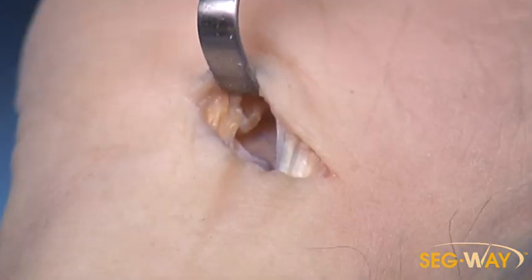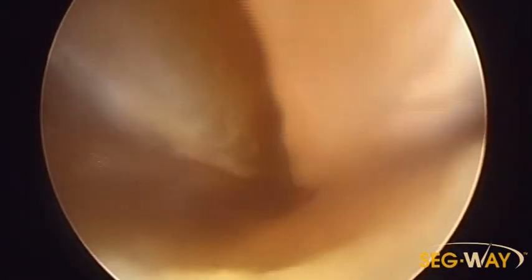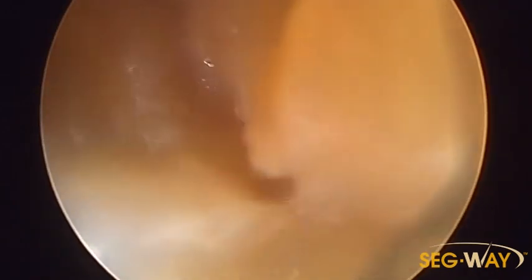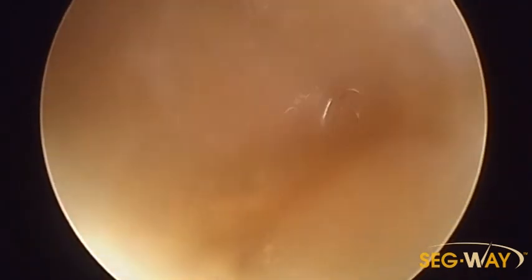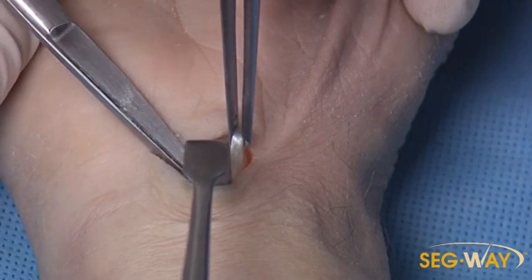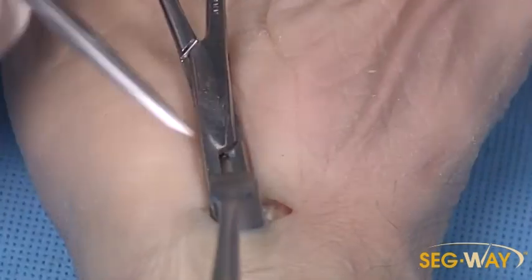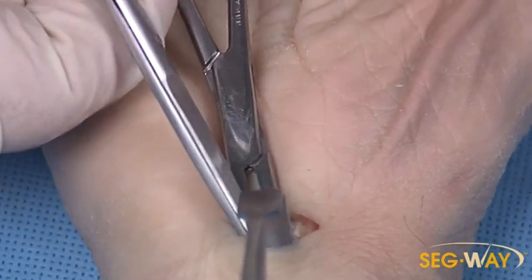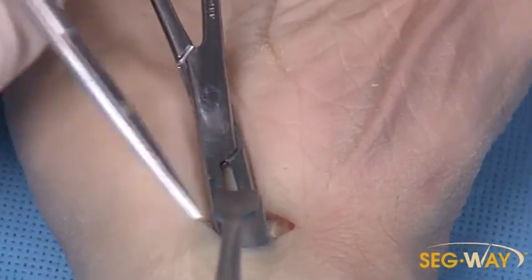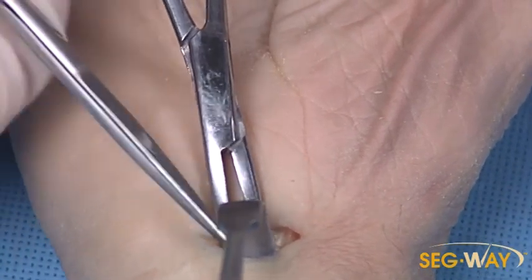There's the cut edge right here. Put the camera back in and you can see the entire cut edge of the ligament all the way down — it just opens right up as you follow it. Then to complete the proximal portion under direct visualization, this is the forearm fasciotomy. I put a curved hemostat right in there under the edge and snip it, just like that.